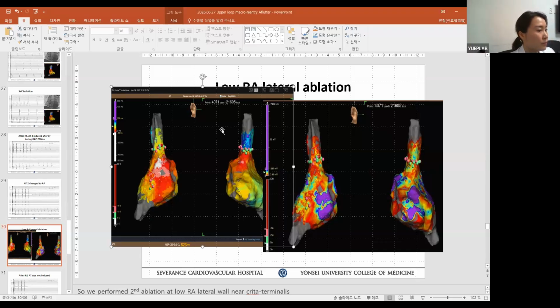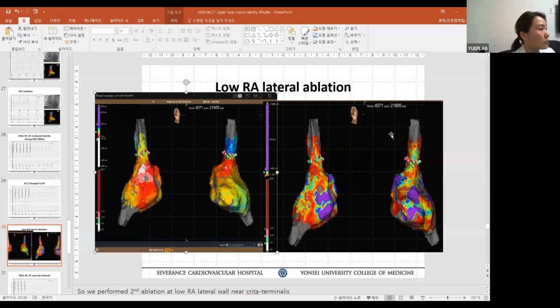When you ablate the right atrial free wall, please shape the catheter like this. Okay. If it's straight and you push, you can make a hole. So it's safer. But nowadays, because we have contact force, it's easier and safer. But don't forget, the measurement by current modern technology is sometimes wrong. Okay.